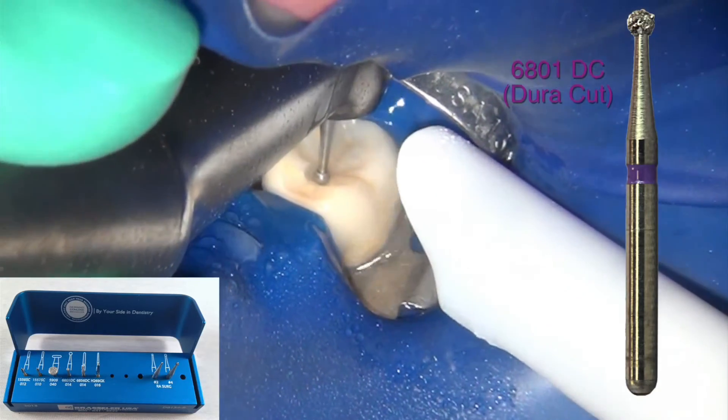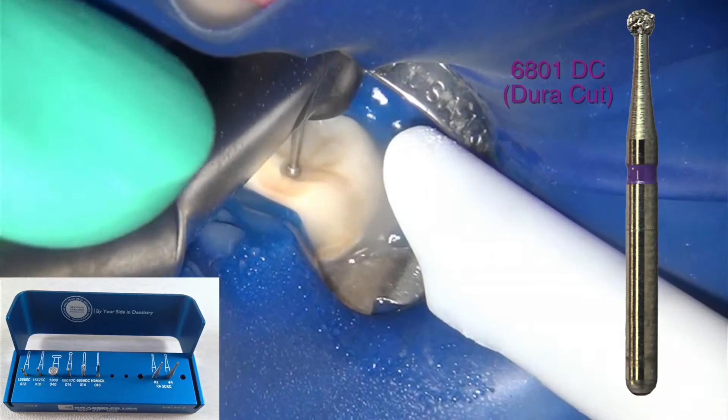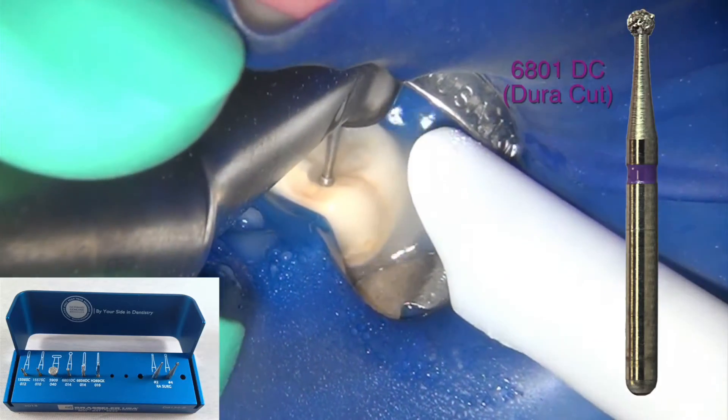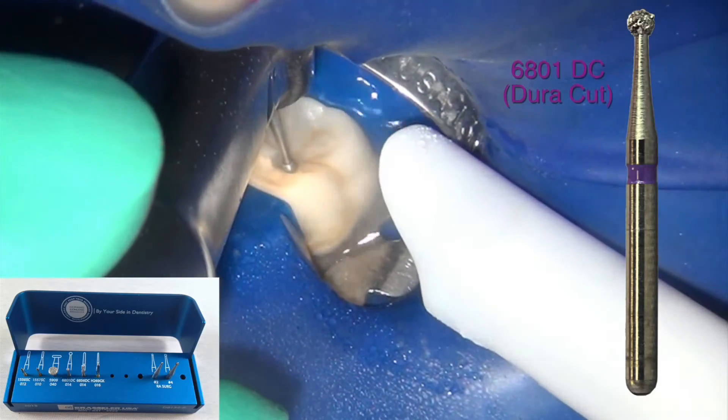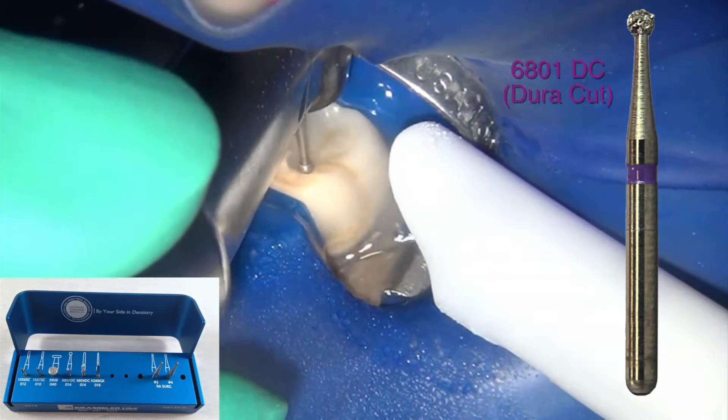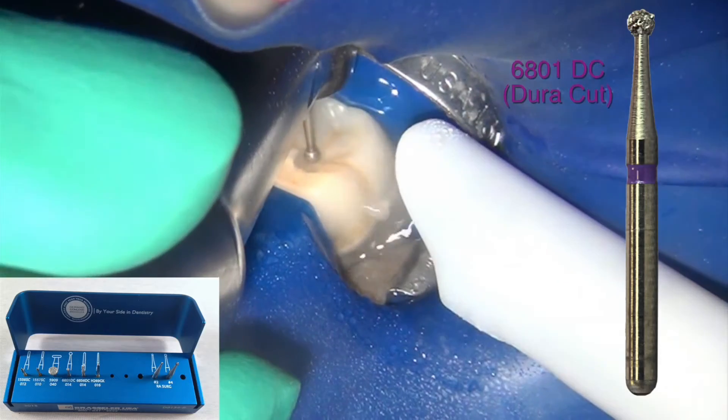The fact that the diamonds are a little bit shallower helps in creating less heat on the surface, which is very important with modern crowns — minimizing the amount of heat involved is critical.